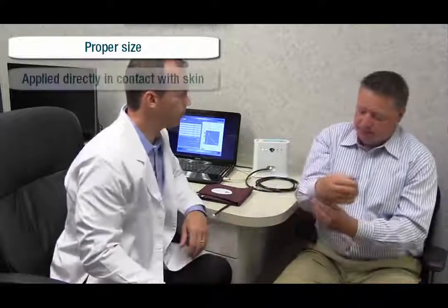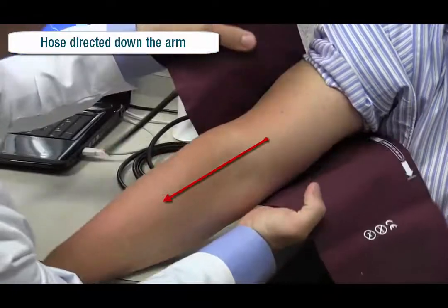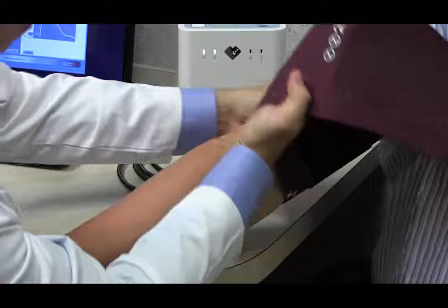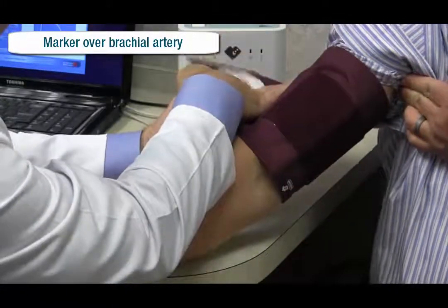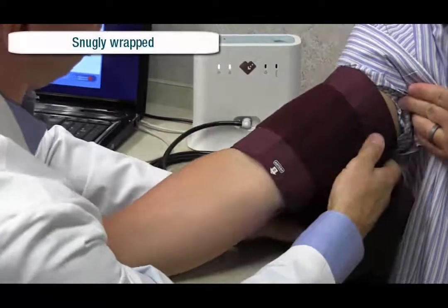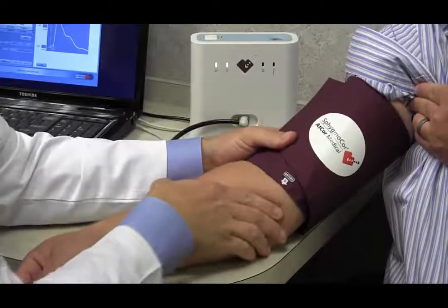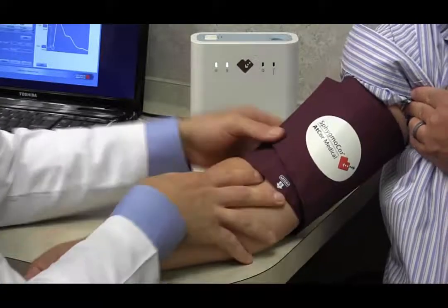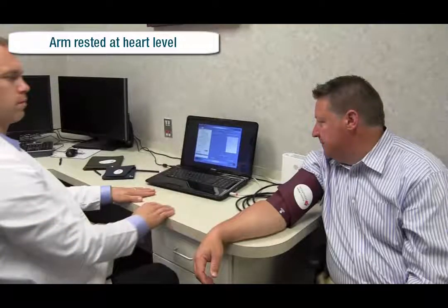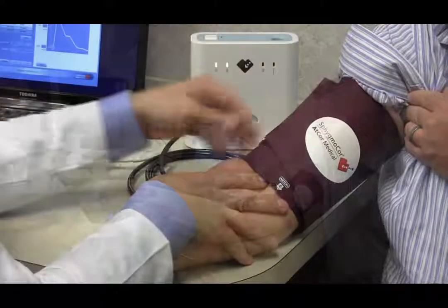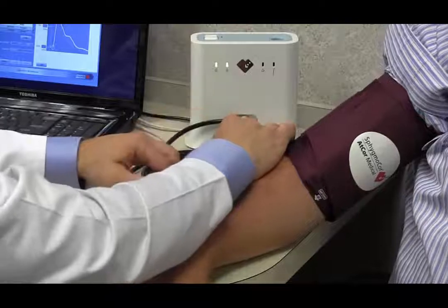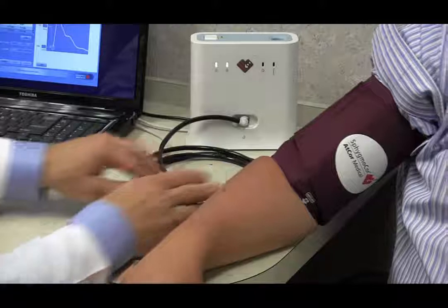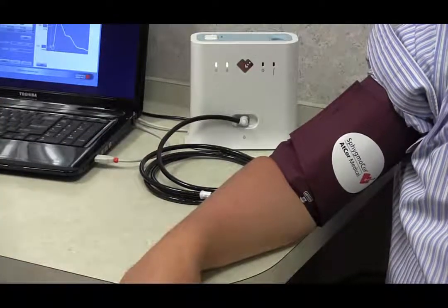Place the appropriately sized cuff on the patient's arm, directly in contact with the skin, with the hose directed down the arm. As the cuff is wrapped around the arm, ensure that the index marker falls within the defined range and that the artery marker is over the brachial artery. The cuff should be snug but not overly tight. It should be possible to fit two fingers between the cuff and the patient's arm. The patient should have their arm comfortably rested on the table or bed at the level of the heart. Attach the cuff to the hose from the module using the white plastic connectors. Insert the connector on the hose into the cuff connector and rotate clockwise to secure the connection. An audible click will be heard when the connectors are secure.